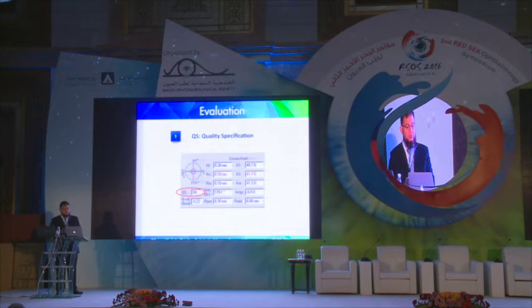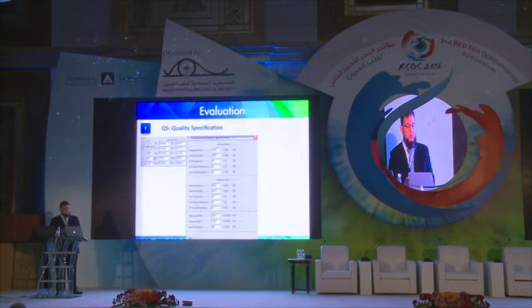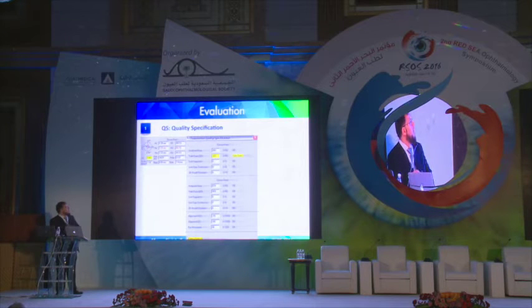Starting with the quality specification, when it is okay, it means that all data are complete and within the acceptable range according to the machine. While when I have yellow, like data or something, it means that there are missing data and I have to recapture the patient.